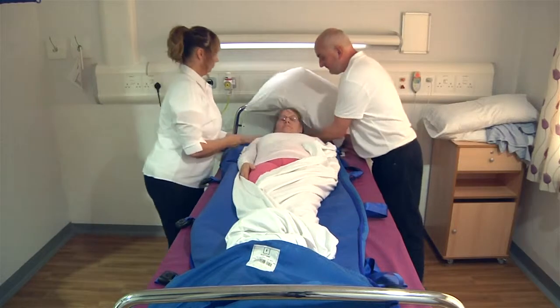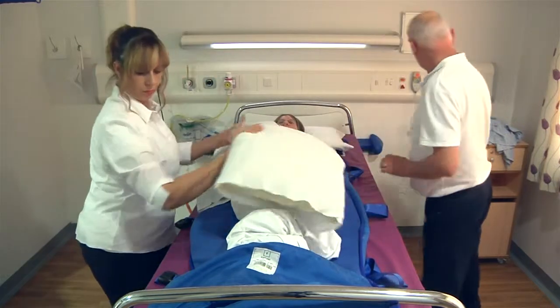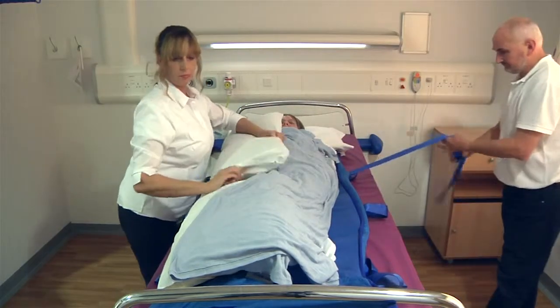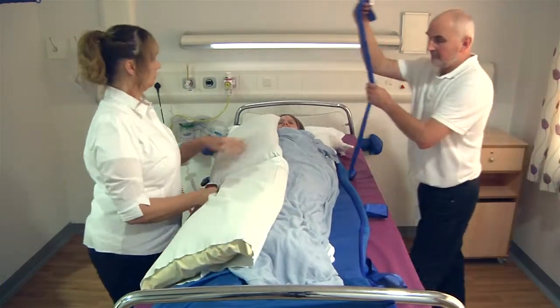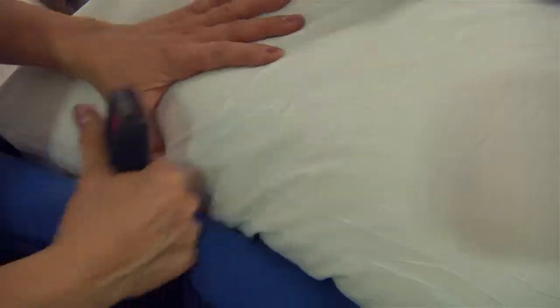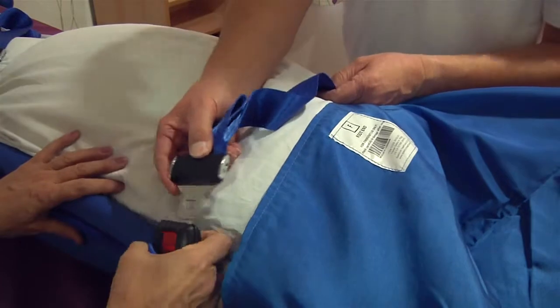Place the spare pillows across the chest, legs, and one under the head if enough are available. Working in pairs, secure the cross straps in a diagonal position and tighten to cocoon the patient on the ski sled. The straps need to be tight but comfortable for the patient. To prevent tripping, ensure the loose strap ends are tucked under the cross straps.